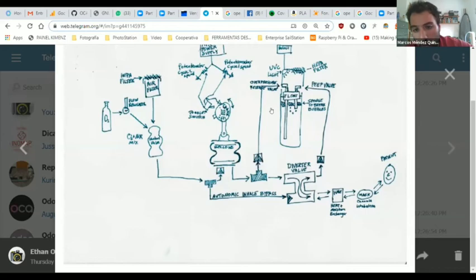Inside this tube, after the expiratory cycle of the patient, we have bleach here, bubbling. We have a sponge to reduce the bubbles. And we have a UVC light that we are trying, it depends on the resources that people have, but you can put a resistance here to keep this bleach hot or warm at 60 or 70 degrees. So the virus will be annihilated without the need of an N95 filter. But of course, if you have one, it's better. Everything additional is better.